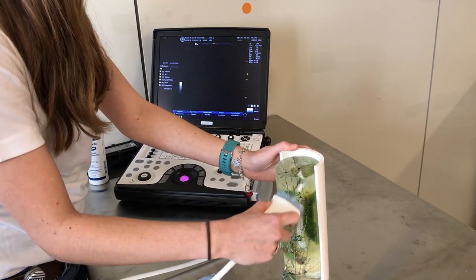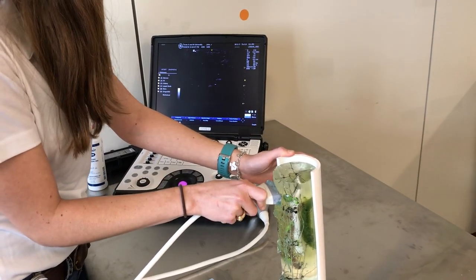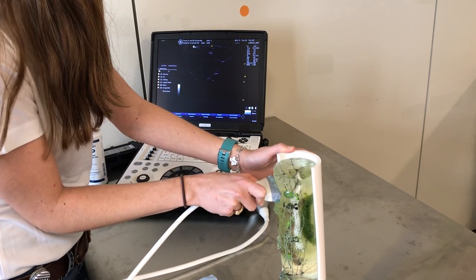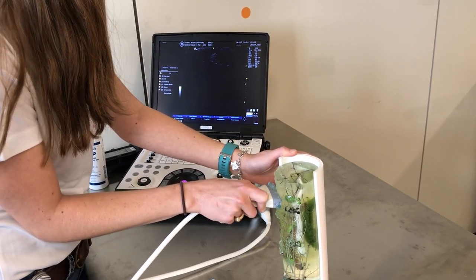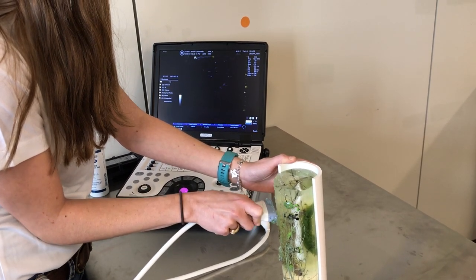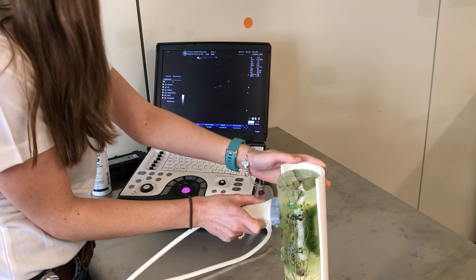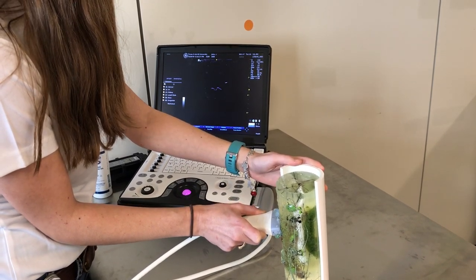Whenever you go to ultrasound, make sure you start proximal on the limb, find your structure, and then follow it distally like we are doing here. We always want to make sure our structure is in the middle of the screen, and we're just going to follow it down.